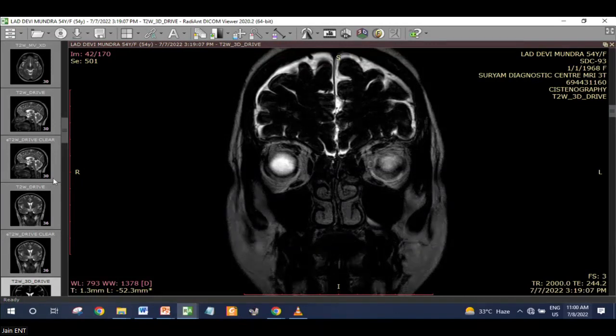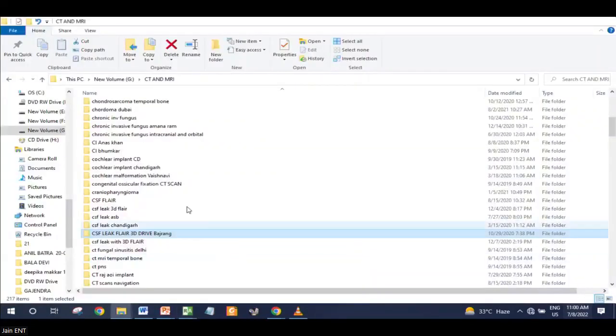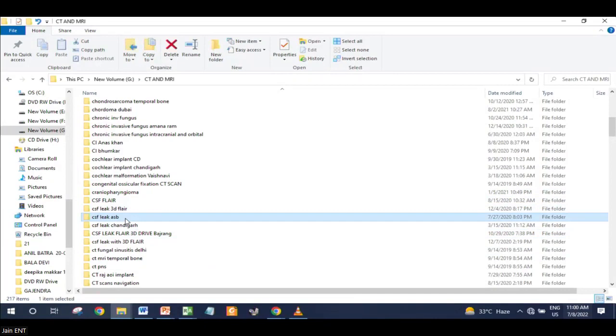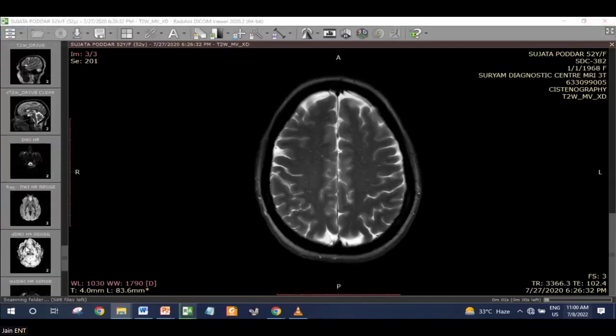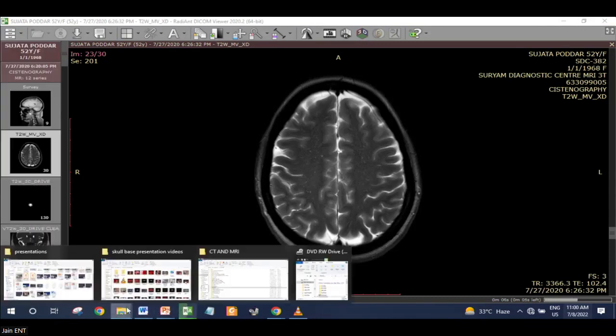Yes, please go ahead. Thank you, sir. I will show you some of the venograms if I get them now. This is not the venogram.